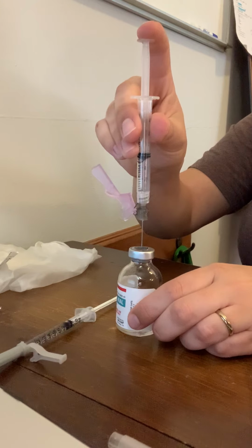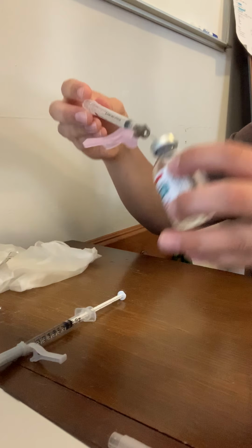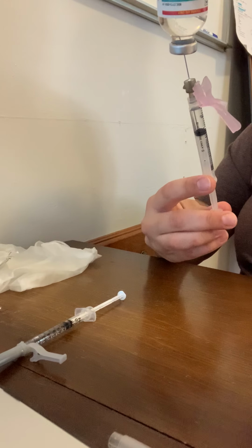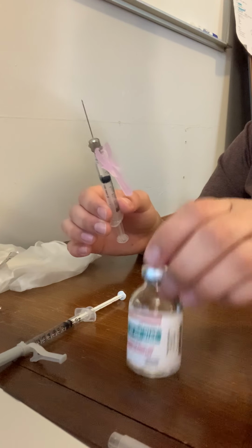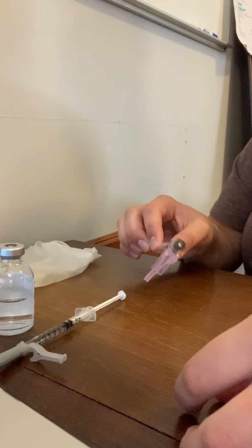I'll inject that air into the top of the vial since my needle is long. And then I'm going to draw up my 1 ml, make sure I don't have any bubbles. Okay. So that is my Phenergan.